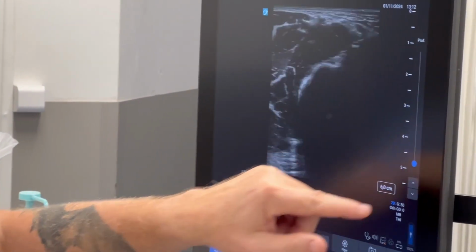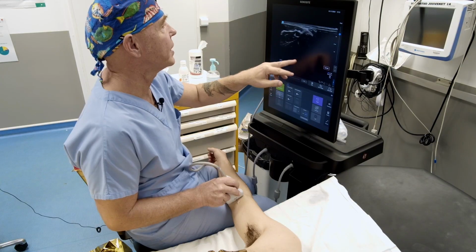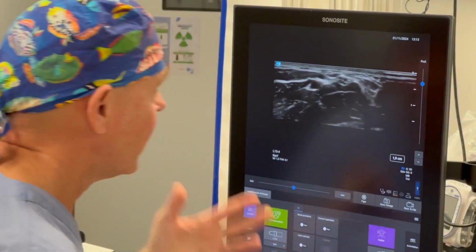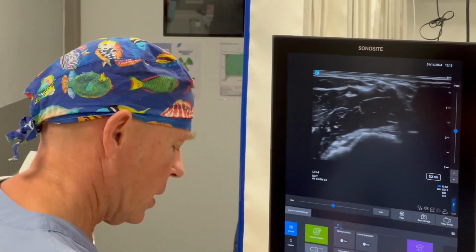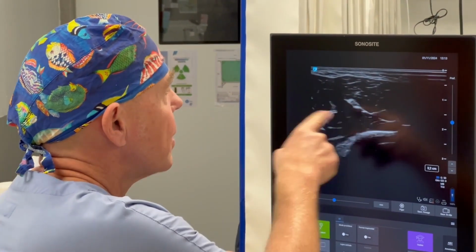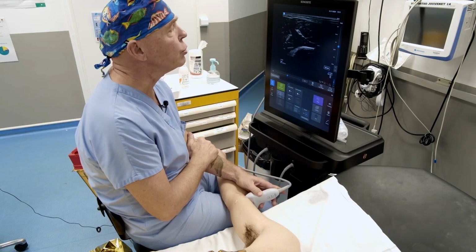To focus a little, I have a new ultrasound machine. There you go, like this. And you can find the image of the artery accompanied by a median nerve. The puncture will be done in this direction. Now look here, I'm taking a slightly wider field, just a bit more. And I rotate 180 degrees. And I get back my image of the radial nerve that we saw in step 1 with the humerus. And then this little image shaped like this. And so I can do an additional injection at the elbow.